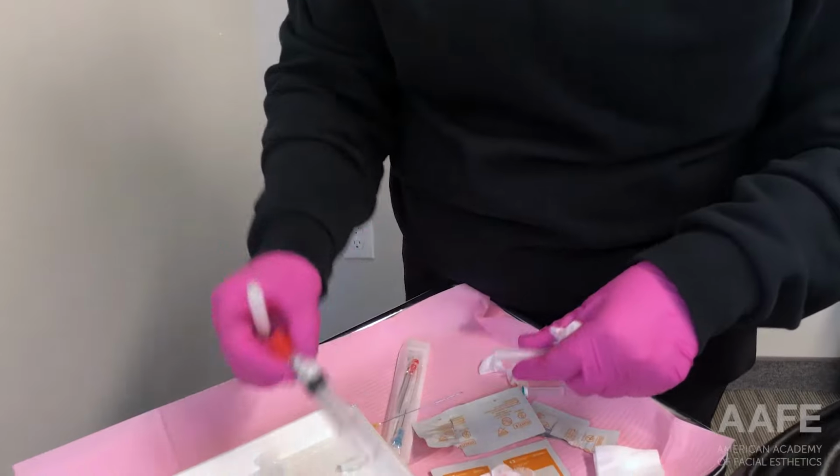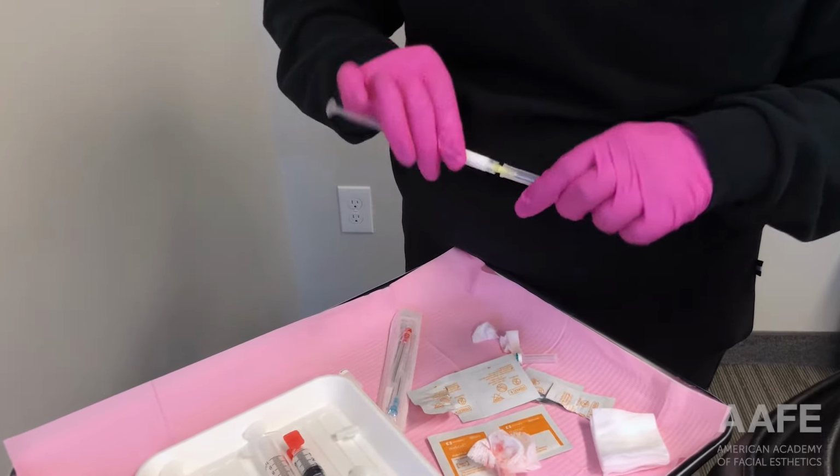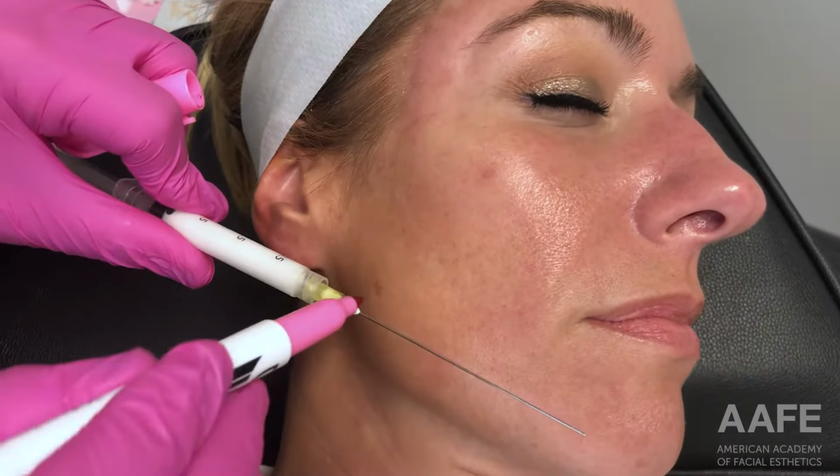They consider Hyperdilute Radiesse to be anything greater than 1:1, meaning 1 part diluent to 1 part Radiesse. In this particular case, we are treating her with 1:1, so they consider that dilute Radiesse rather than hyperdilute Radiesse. Hyperdilute Radiesse would be anything greater than that, so 1:2, 1:3, and so on.